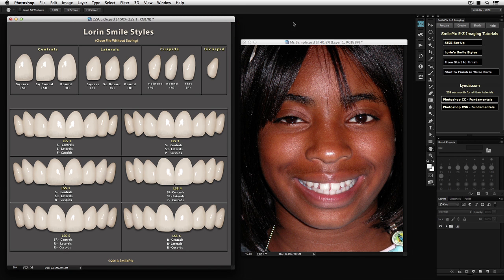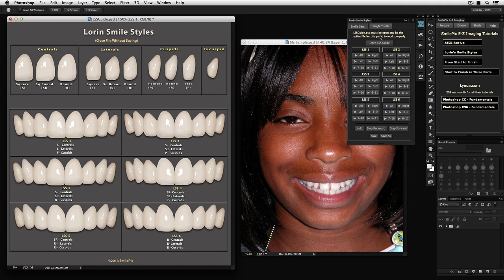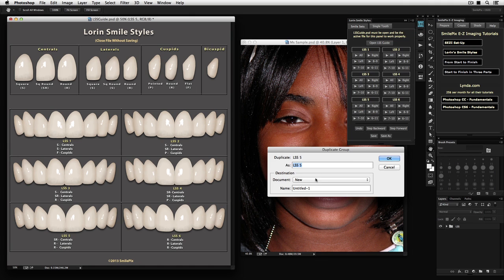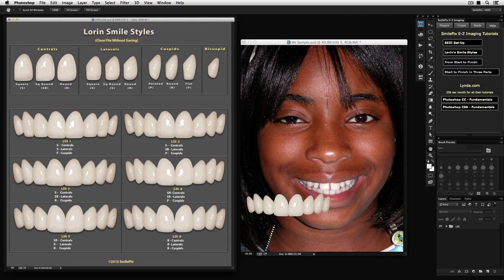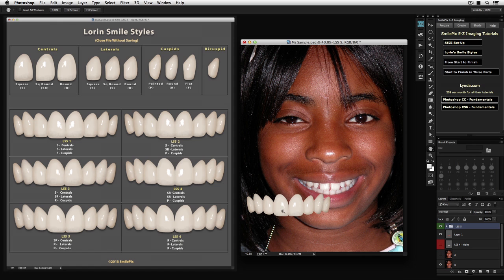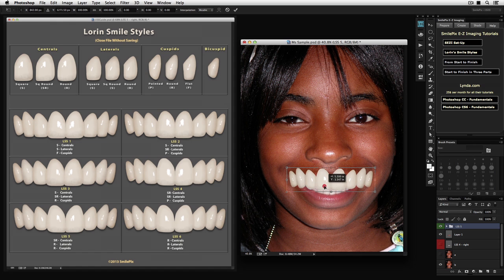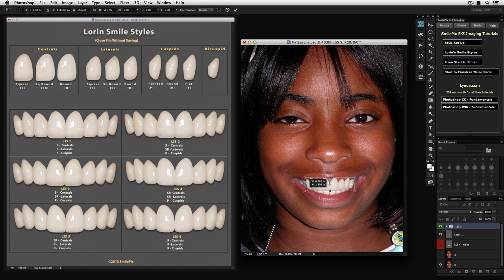Now we are going to place the teeth in a photograph. We are going to select LSS 5 All, which is eight teeth. The teeth are now moved into position with the Transform tool and scaled down. The Lauren Smile Styles, because they are not photographs, are easily scaled up or down without resolution issues.